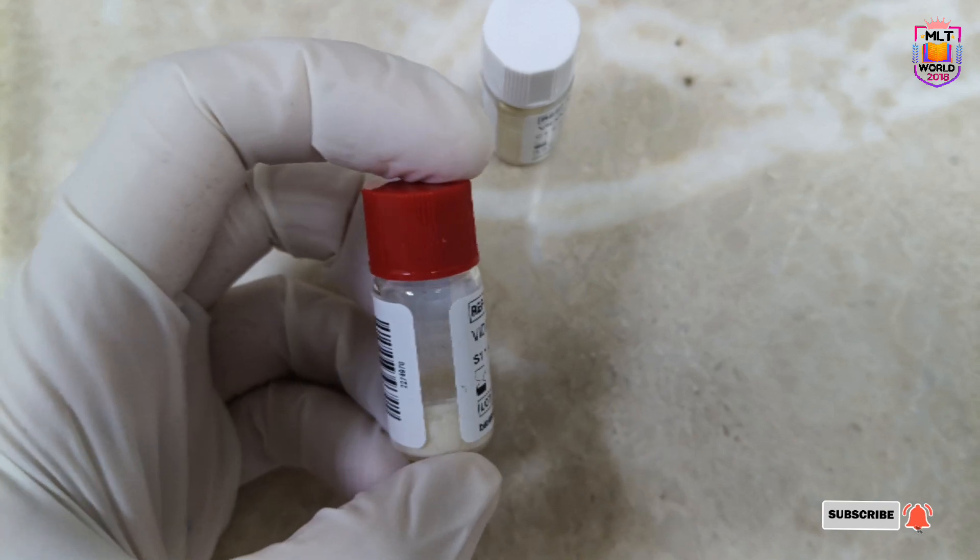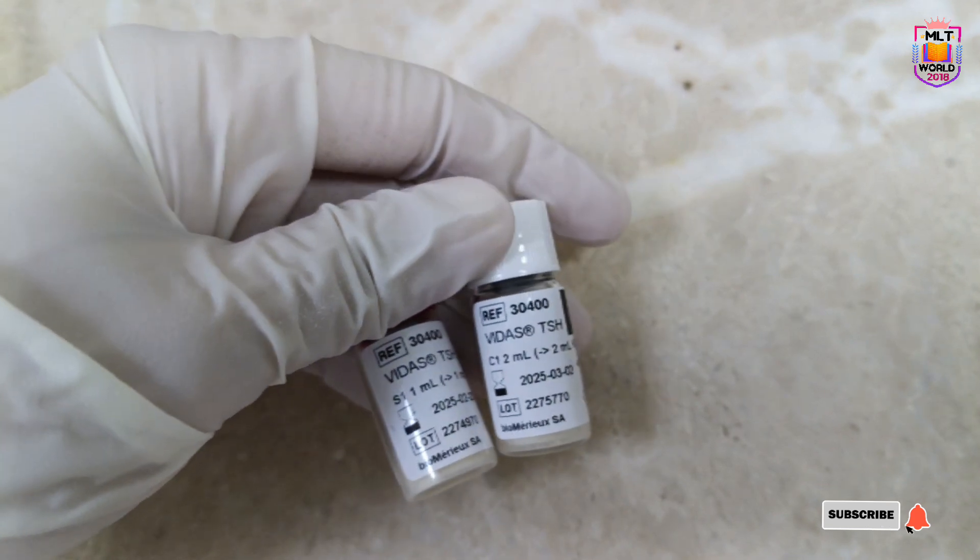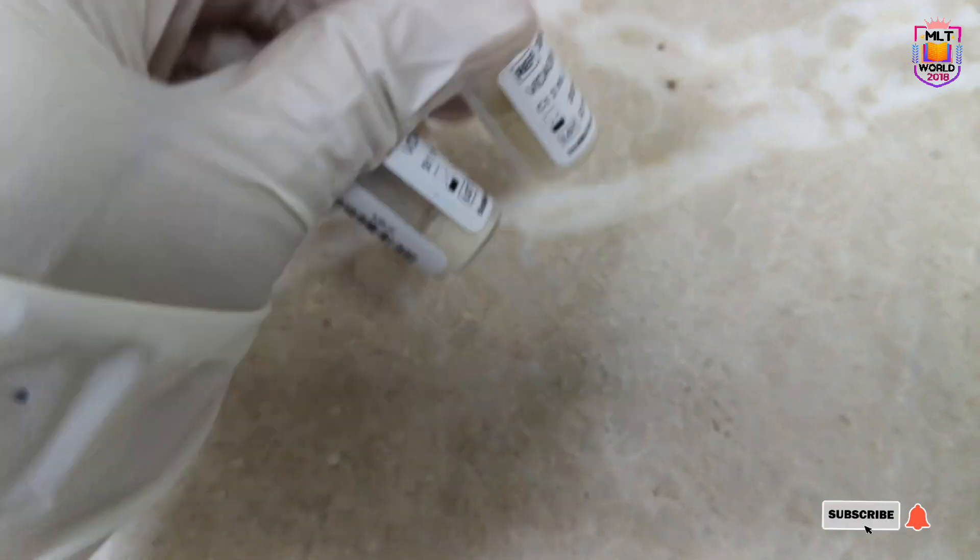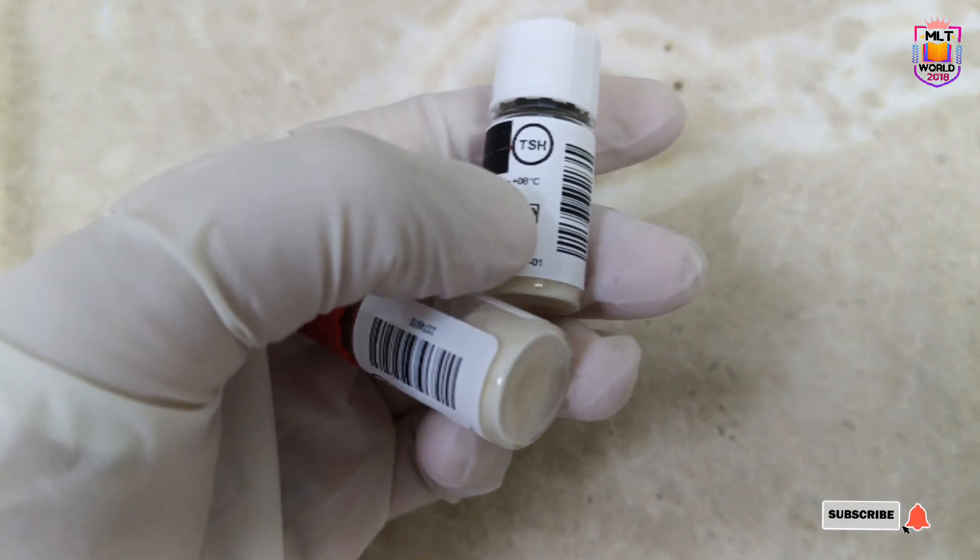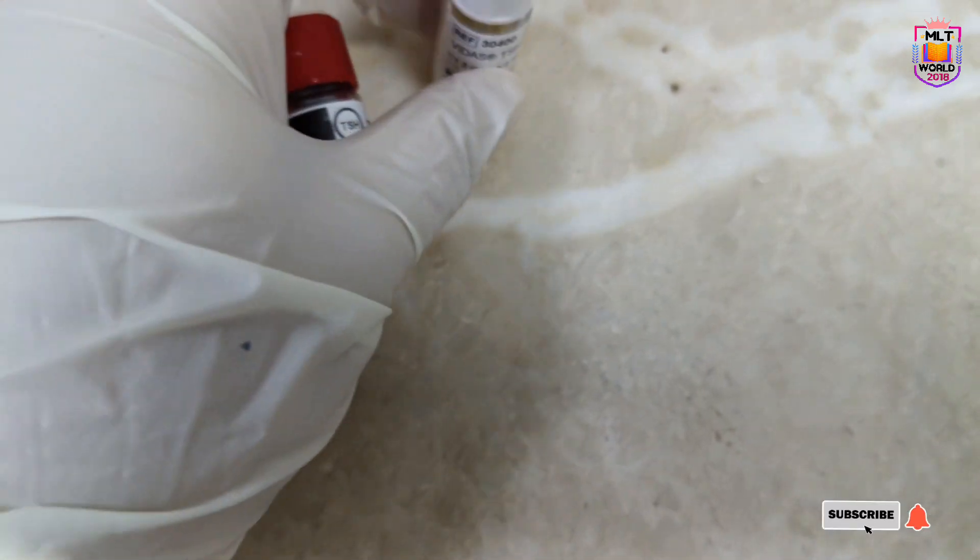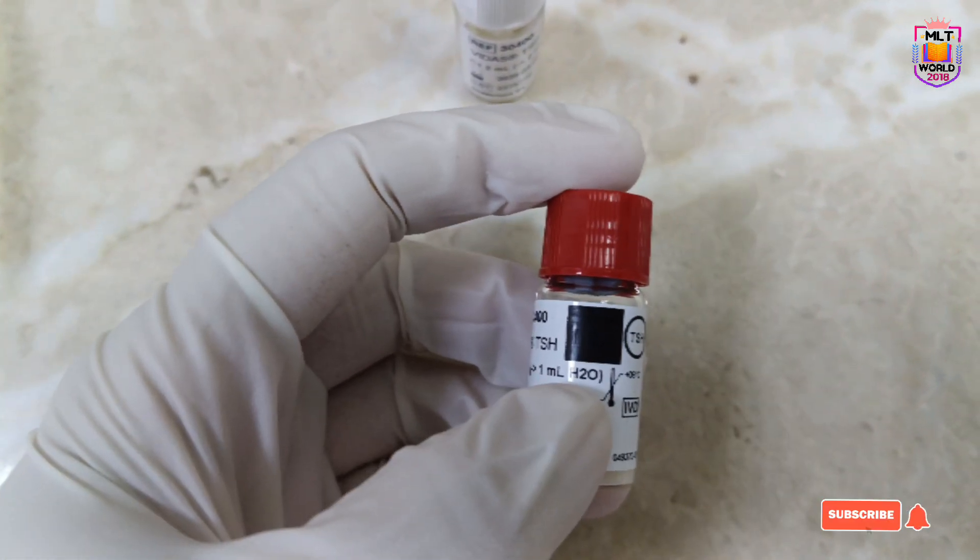First, check whether you need to dilute your control or calibrator with distilled water or with a diluent, because sometimes diluent comes with the kit. Then bring the control and calibrator to room temperature, and after that we will dilute with distilled water. Check how much water or diluent is needed for dilution.